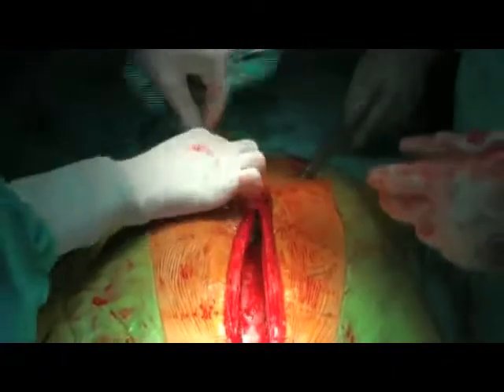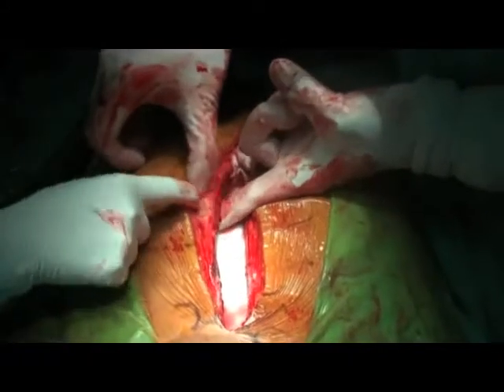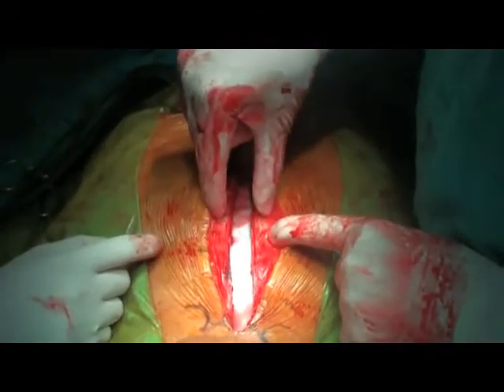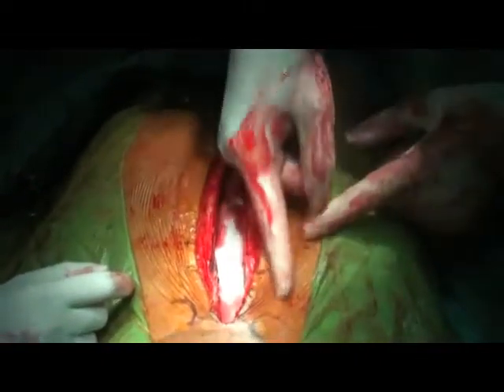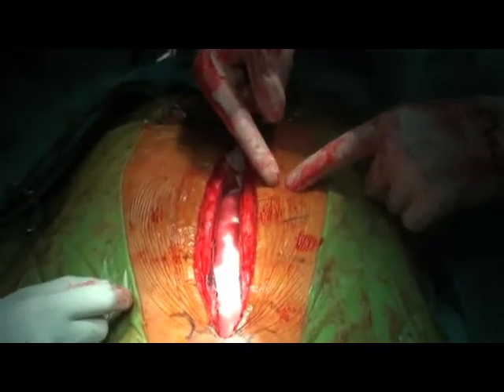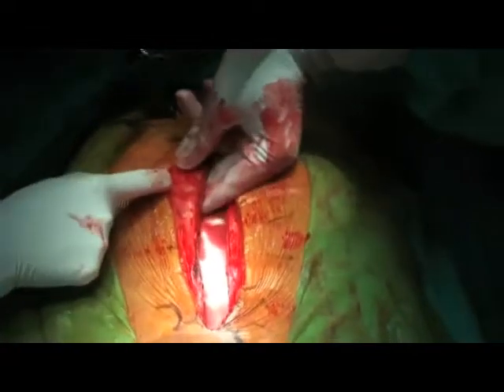The same procedure is done on the left side as on the right. A large sponge is placed behind the sternum to protect the underlying heart. You then check the width of the sternum to decide whether to put the external wires through the substance of the sternum or through the intercostal spaces around it. In cases where the sternum is very weak, put the wires in the intercostal spaces to get more substance. In patients with pulmonary disease, emphysema, or bad cough, you should take the sternal wires through the intercostal spaces.